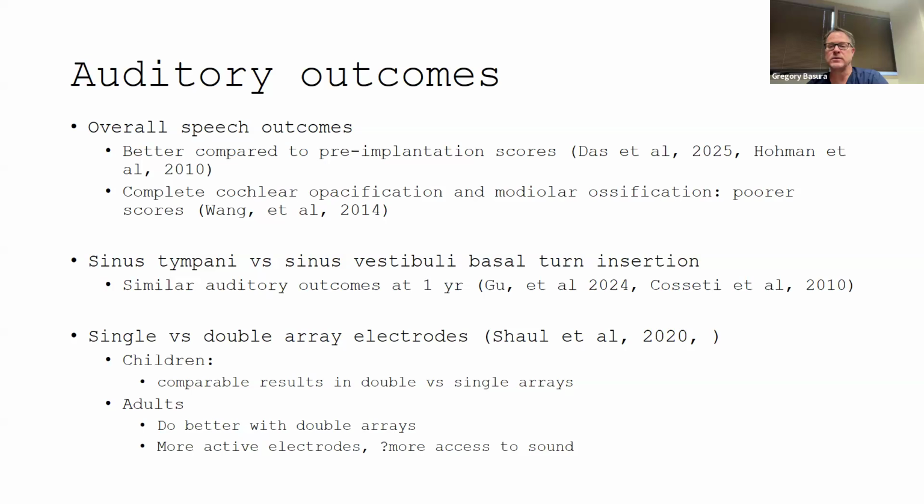So kind of what you described there, I was able to open the basal turn near the round window opening, and then do almost like a pseudo drill out of the fibrosis.